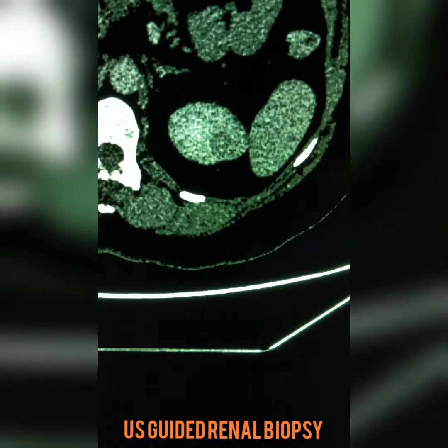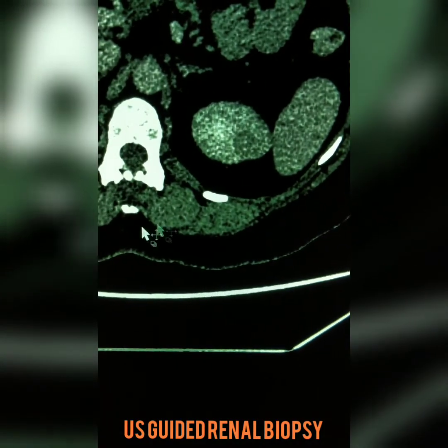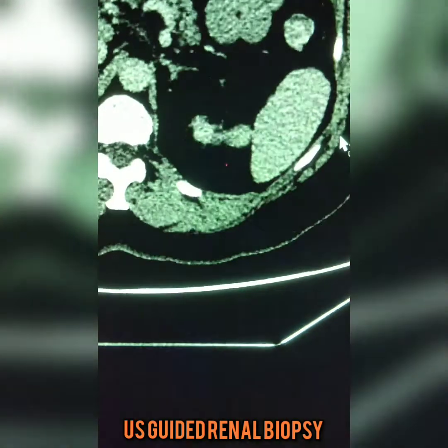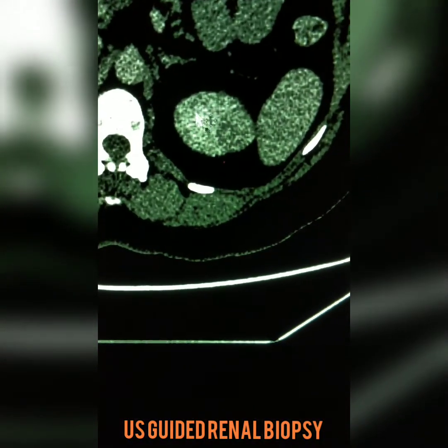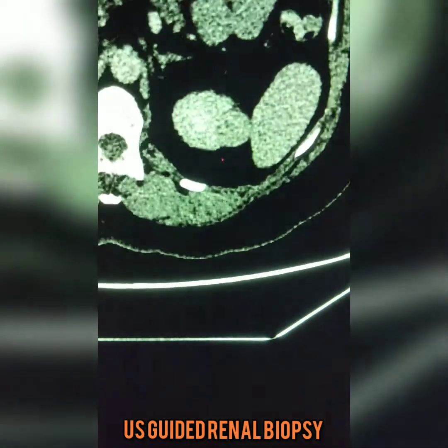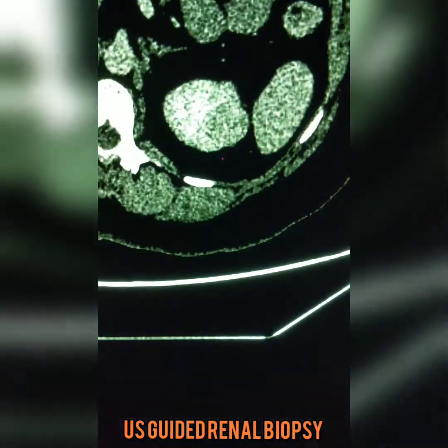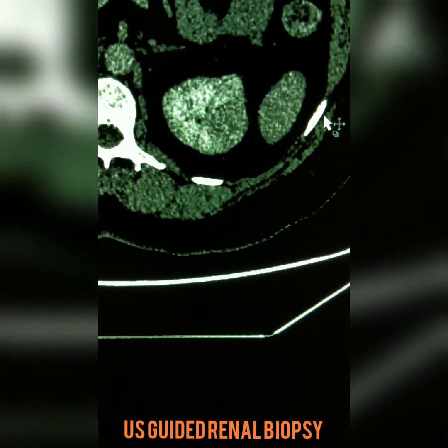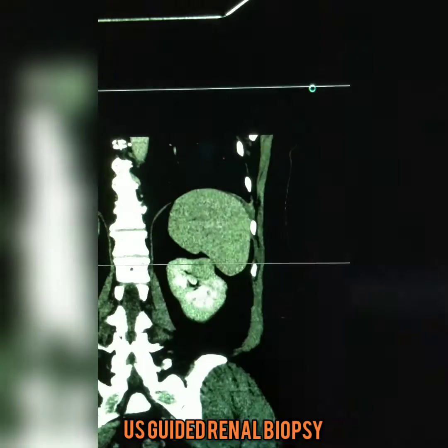This is now the CT scan. That's the spleen; this is a transverse cross section — like a slice of bread through the patient. That's their spine, this is the top of their left kidney, and here is the mass sticking out a bit from it. If you look carefully, it's a darker grey than the brighter enhancing grey of the renal cortex. The tumor is probably enhancing a little bit, but not as much as the renal cortex. You can see it's challenging because the ribs are here, and we obviously don't want to put a needle in the spleen because it's a vascular organ and we don't want bleeding.